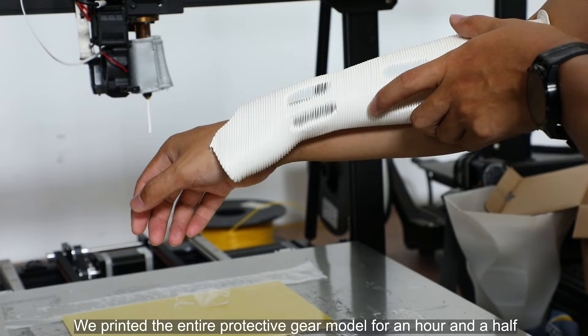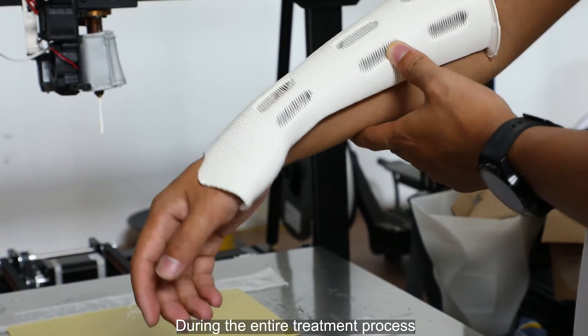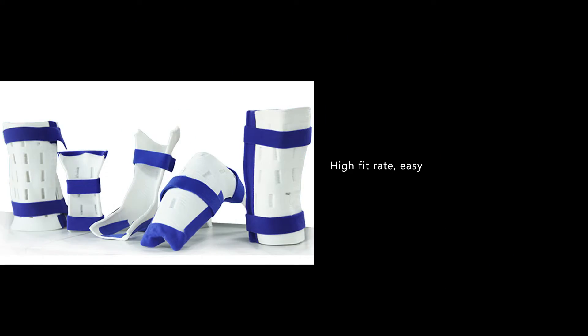We printed the entire protective gear model in an hour and a half. This process improves production efficiency and reduces patient waiting time.